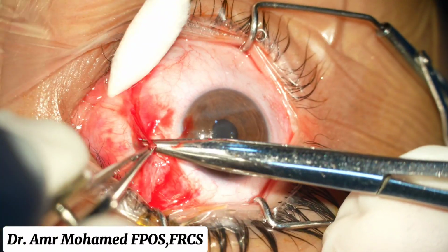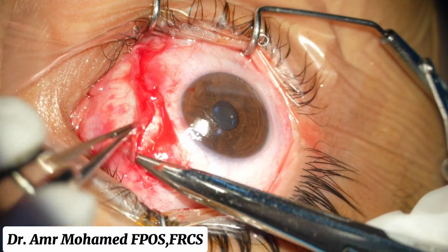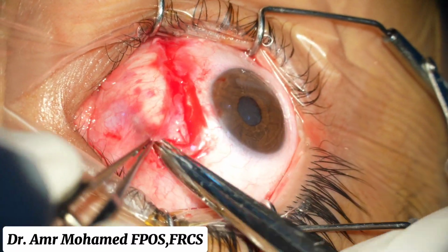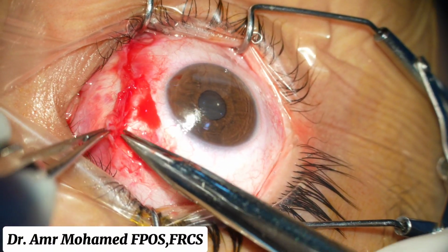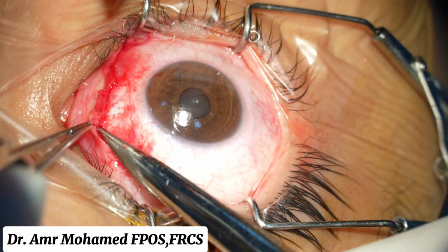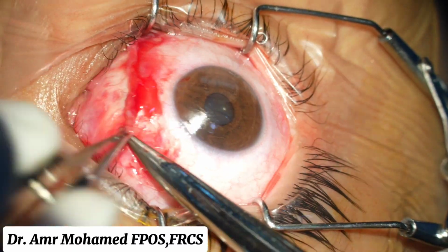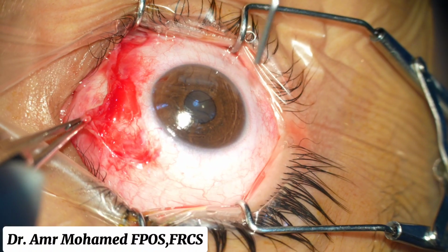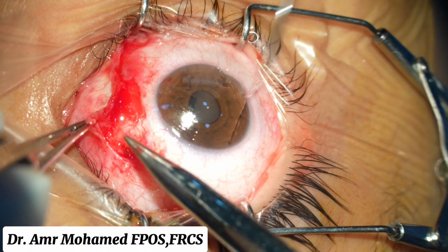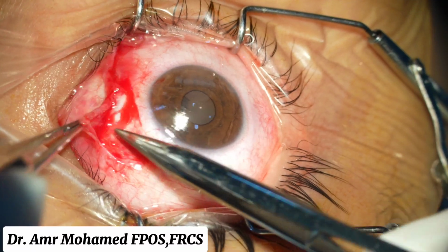Sometimes while dissecting the conjunctiva, you might have conjunctival buttonholing, especially with severe adhesion like this case. Try to preserve the conjunctival tissue as much as possible, and if you have any buttonholing, you can at the end do suturing and close the conjunctival buttonholes.